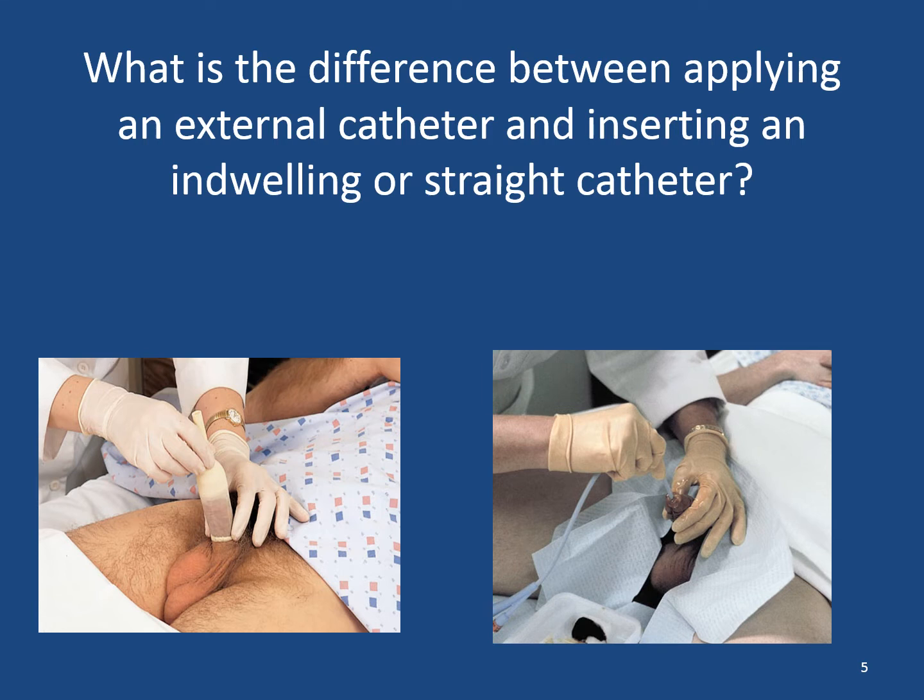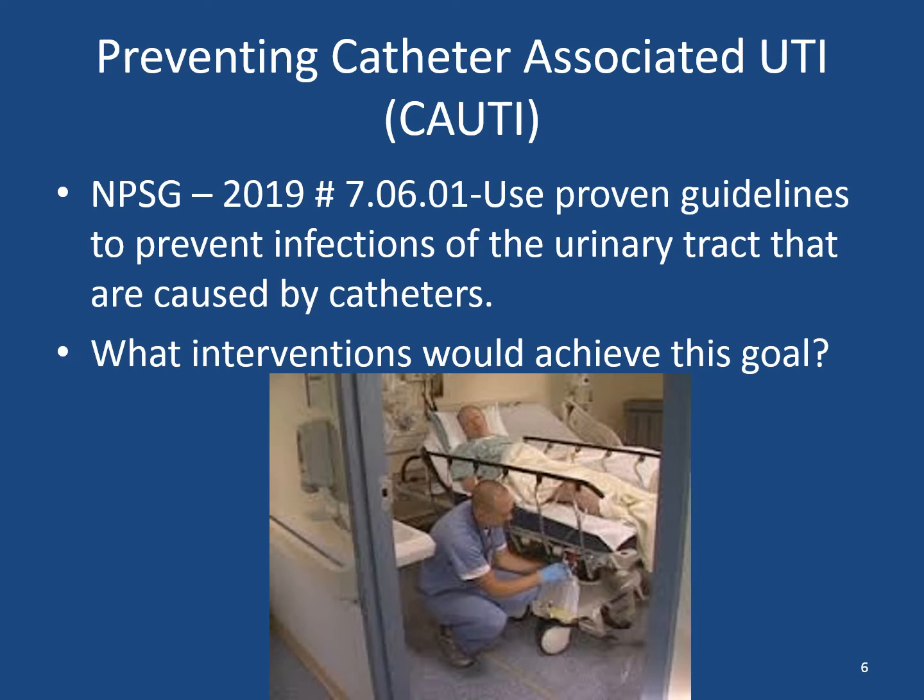To irrigate the bladder, and this would be used for a transurethral resection, to instill medications or fluids as well into the bladder. And it's most commonly a double lumen with a 5 ml balloon that would be filled with sterile saline or sterile water, depending on what is in the kit that you receive.